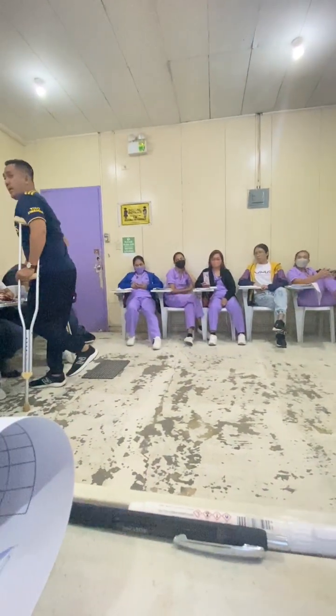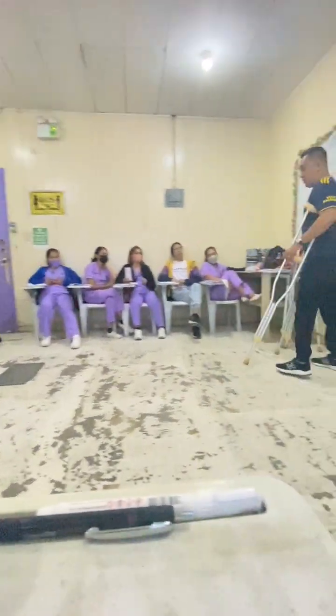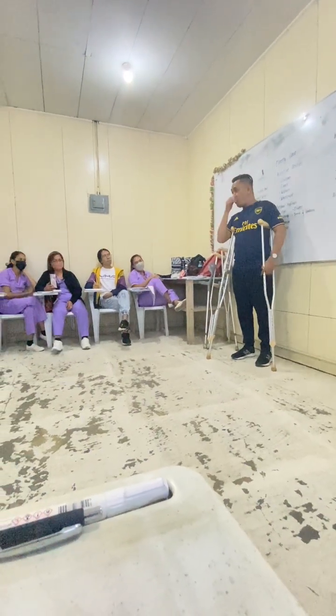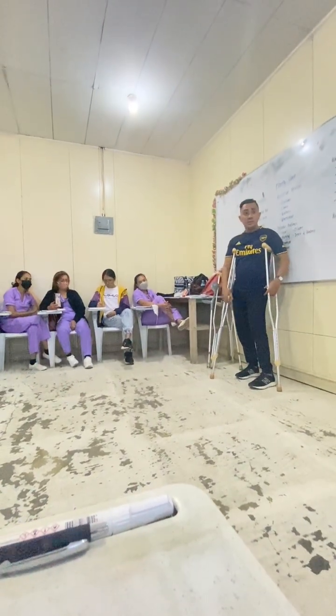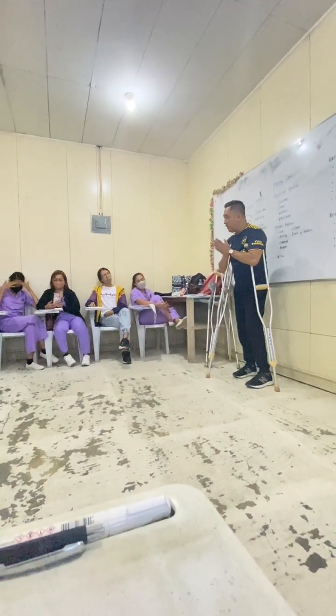Kung familiar na siya sa walking pattern. Swing to sa dili lapas. Dili lapas. Kutob na sa crutch tip. Swing through. Only lapas. Through. The word through, lapas walking is there. Gets in you? So those are the common walking patterns using the axillary crutches there.